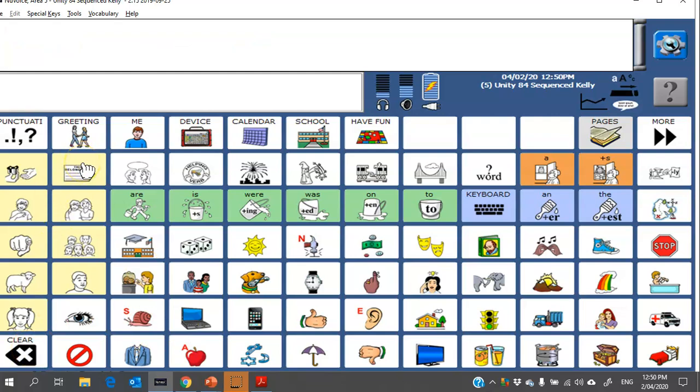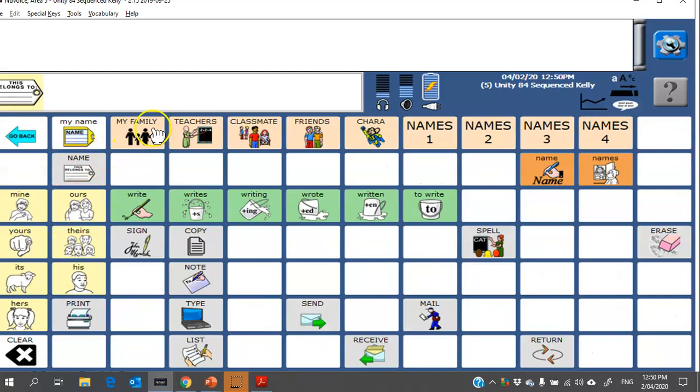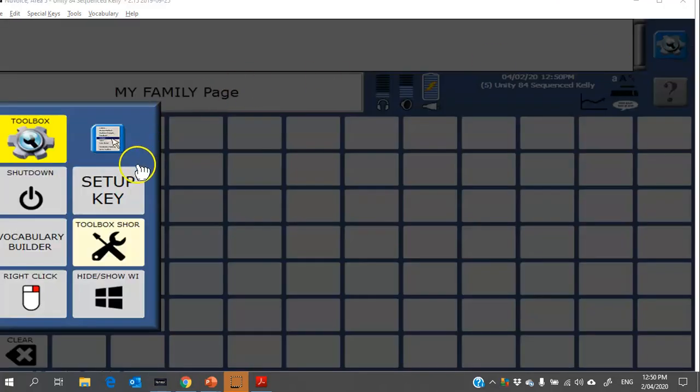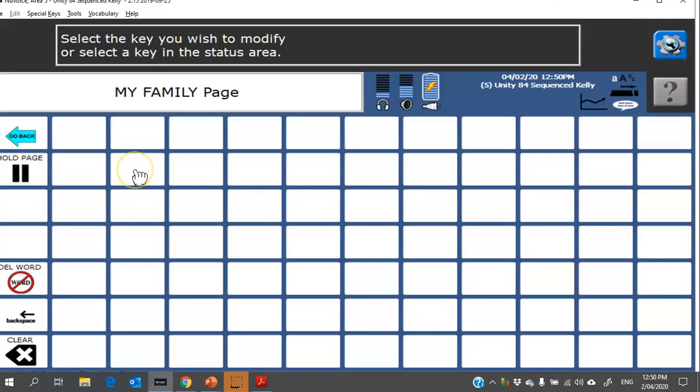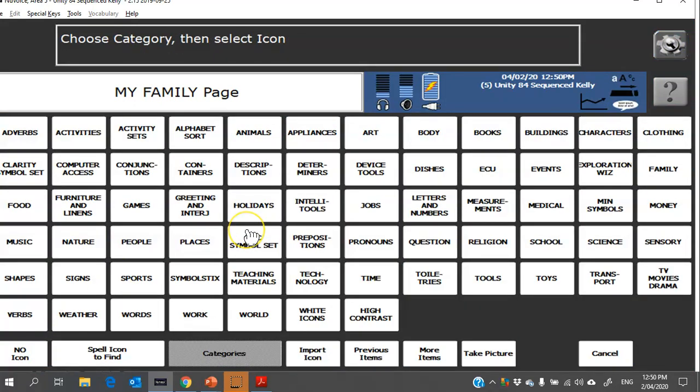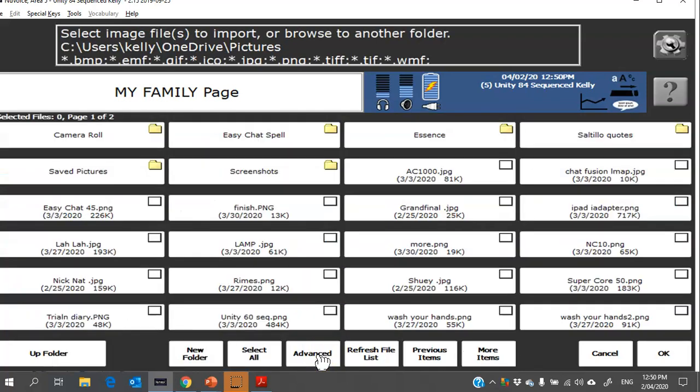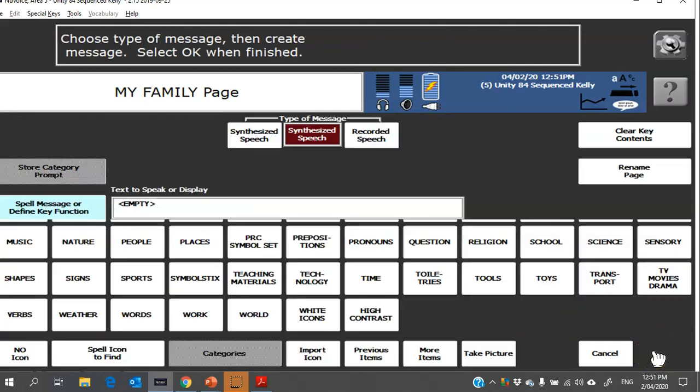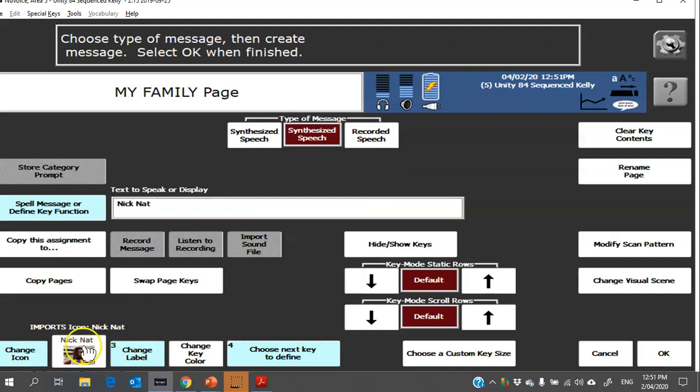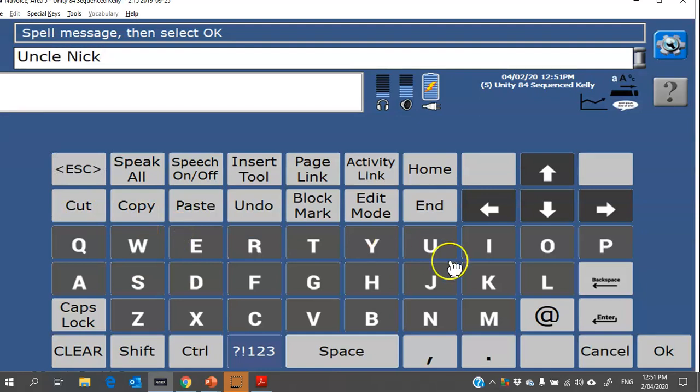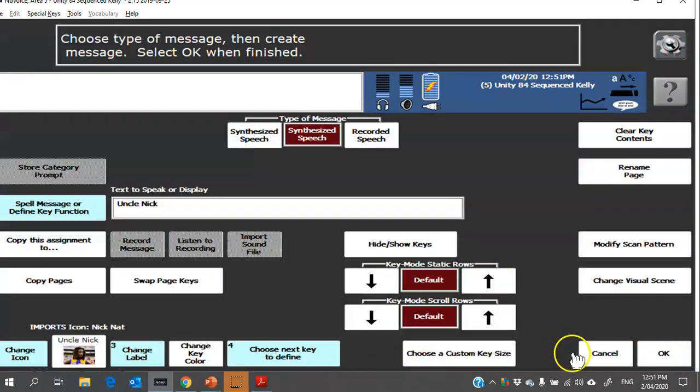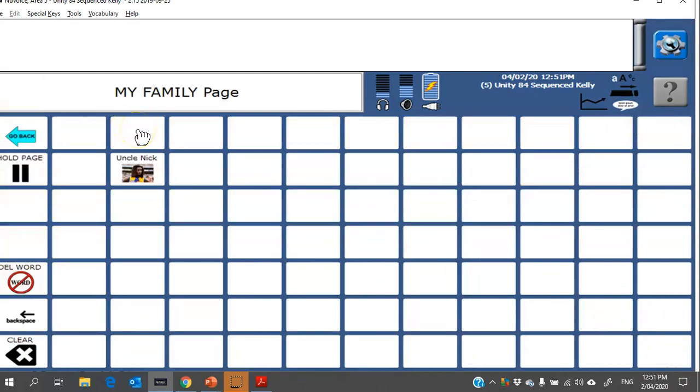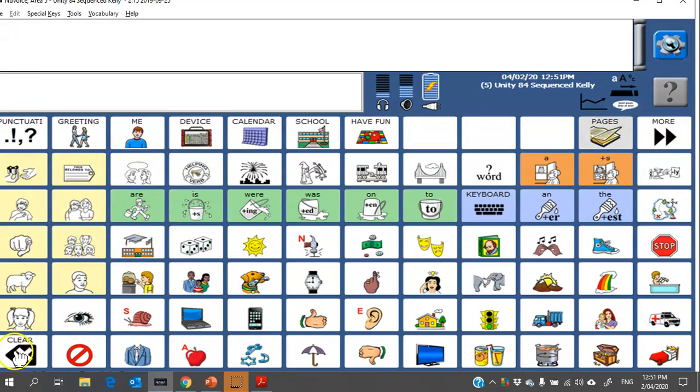Maybe I'll show you under names now, so in Unity 84 Sequenced there is space for all the different people, so I might head in here to my family and I'll follow the same steps. Toolbox, setup key, choose whichever button I want, change icon. From here you might want to add a photograph and you can do that here from import icon. Let me see. Okay, so from here I found a picture of the person that I want to add from my family. I'm going to click OK and because I'd labeled my picture before, it's automatically updated. Spell message, change label. However, if I did want to update those I could go in here and say this is Uncle Nick. Okay. Okay. There we go.